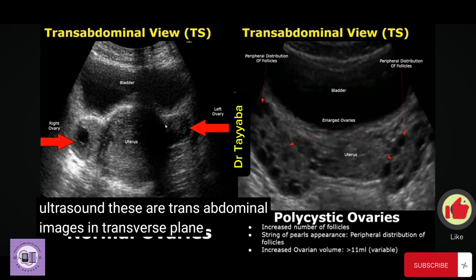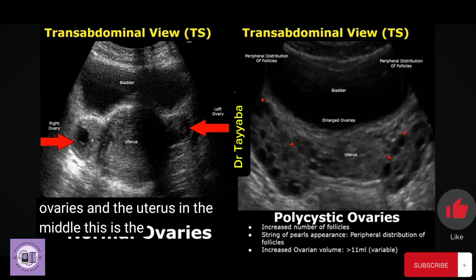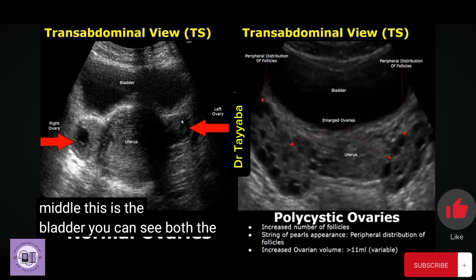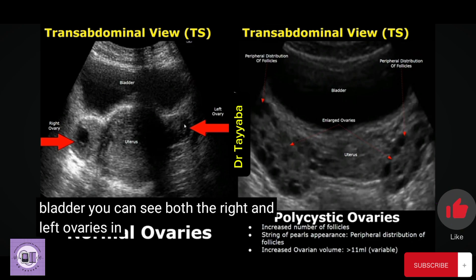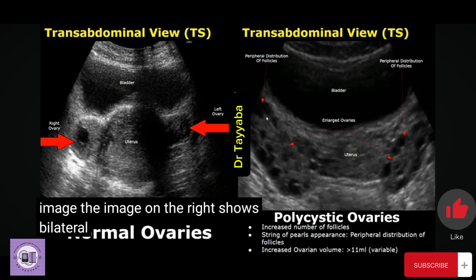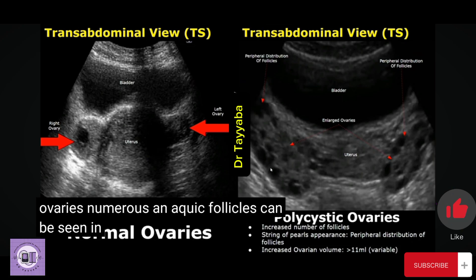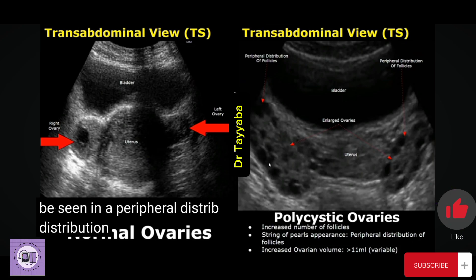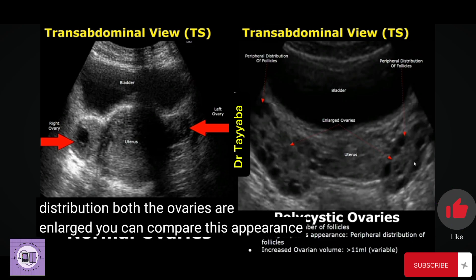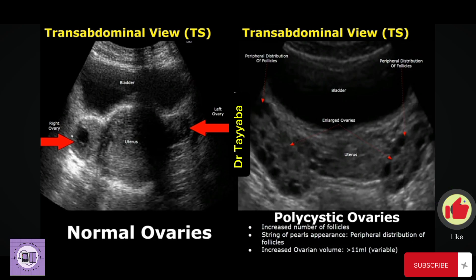These are transabdominal images in the transverse plane showing both ovaries and the uterus. In the middle is the bladder, and you can see both the right and left ovaries. The image on the right shows bilateral polycystic ovaries with numerous follicles in a peripheral distribution. Both ovaries are enlarged, and you can compare this with the normal ovaries on the left.